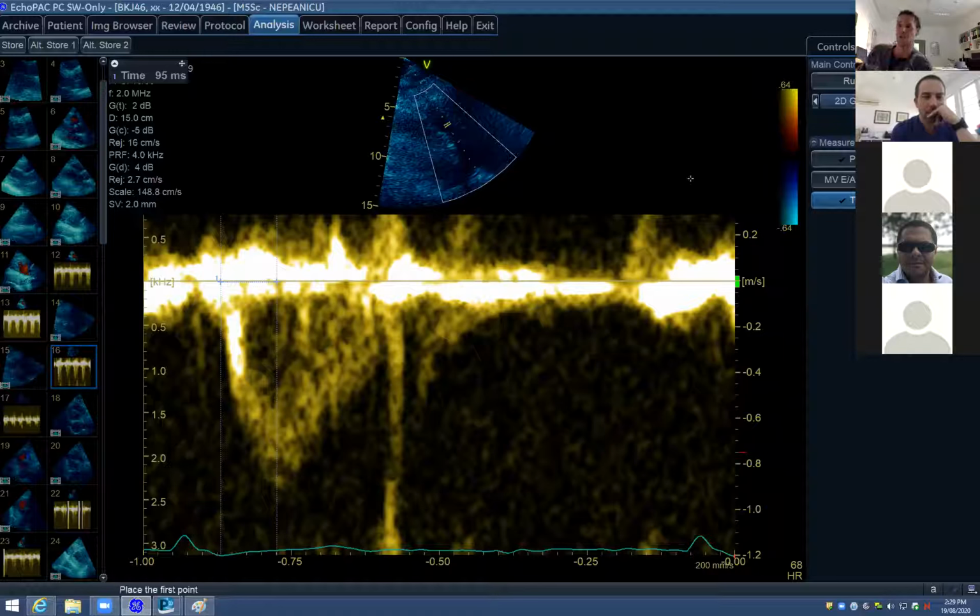So just to pick up on a couple of things that you said. You're absolutely right that pulmonary acceleration time is abnormal if less than 120. That suggests a short acceleration time, which would be in keeping with increased pulmonary vascular resistance. The acceleration time has been best related in the evidence to pulmonary vascular resistance. The notching that you describe is related just to pulmonary hypertension, I think.